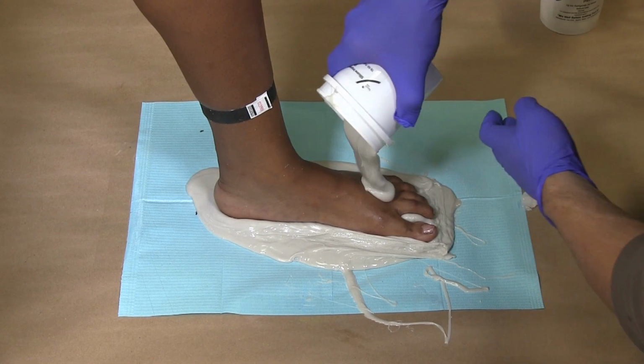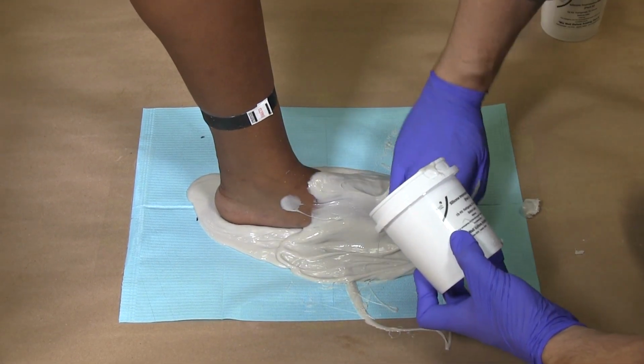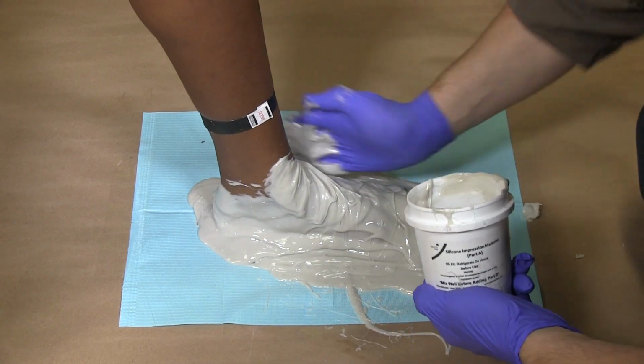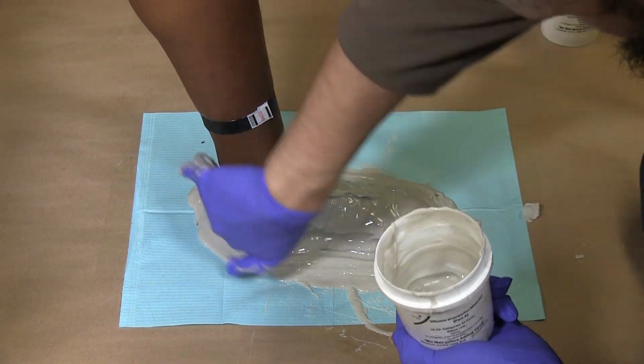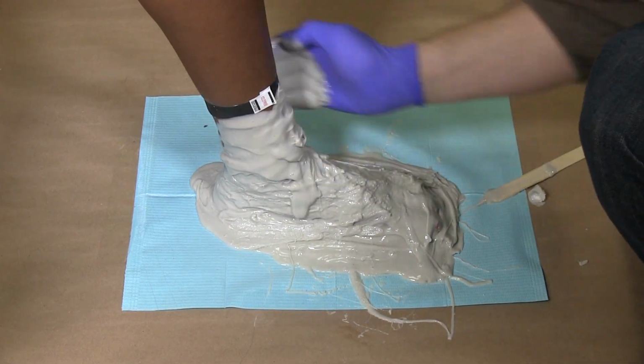Activate more impression material and apply generously to the dorsal of the customer's foot. Make sure the customer maintains a proper pose at a 90-degree angle throughout the process. Apply the material quickly and thoroughly. If holes or thin spots occur, more impression material may be used to fill them in.